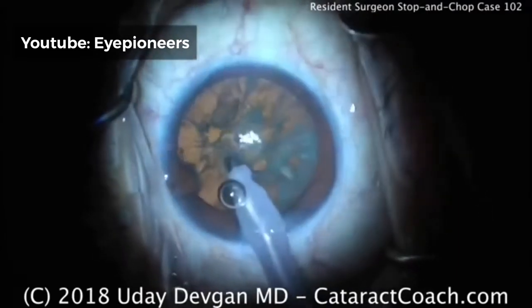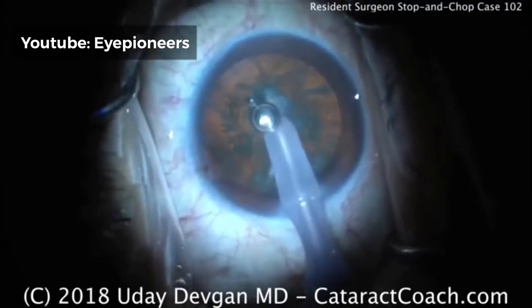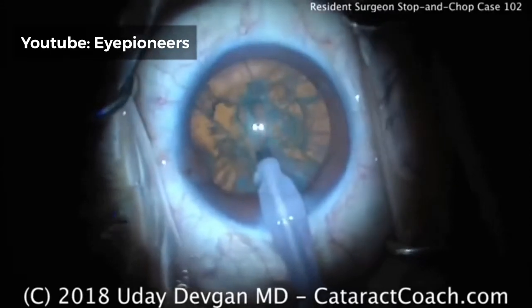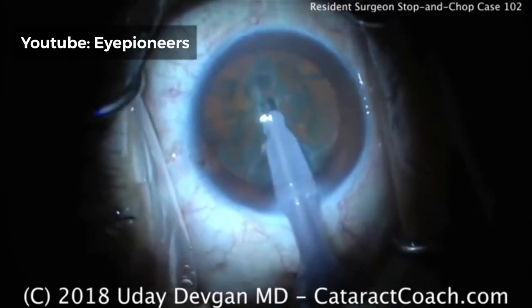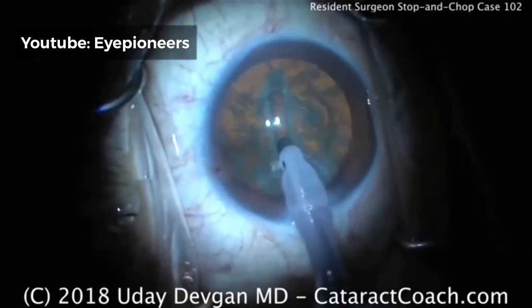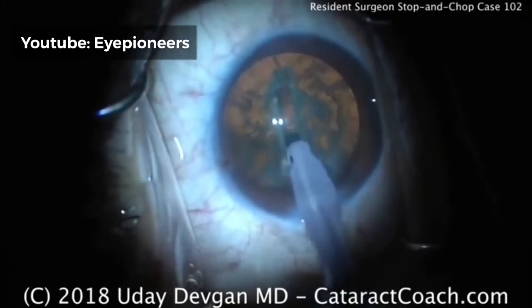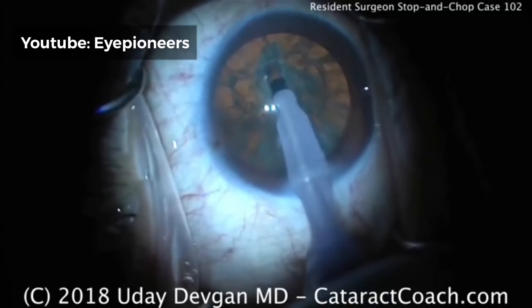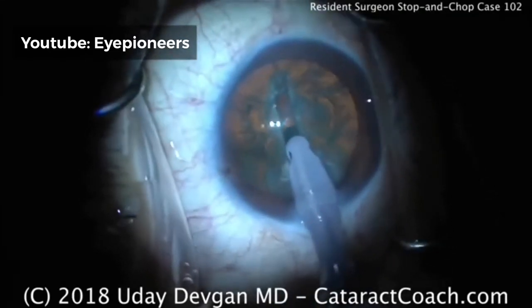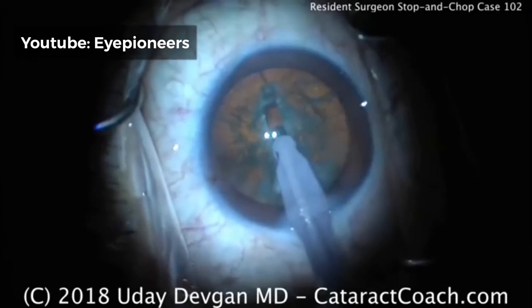Time for the first groove. What I'm looking at is not only the groove itself, but also the corneal light reflex in the center of the cornea — seeing how well the resident keeps the eye in a normal primary position during surgery. The light reflex should stay right in the middle. It's a nice groove here; I'd pull back a little more but start the groove a little earlier. Now widening up the groove. We're not really starting the groove sub-incisionally, so the resident may want to groove this way, then rotate the nucleus 180 degrees and re-groove the part underneath the phaco probe. Nuclear density is moderate.